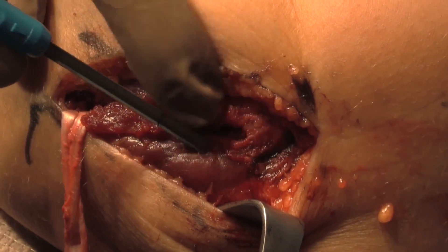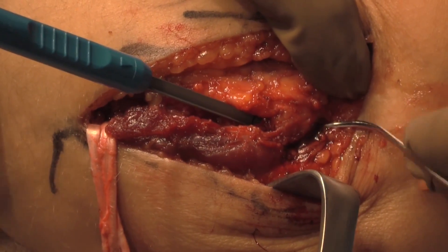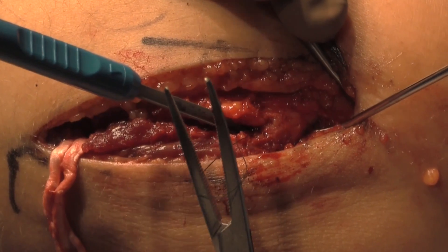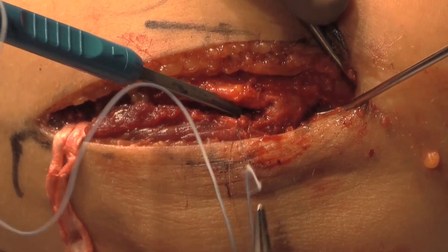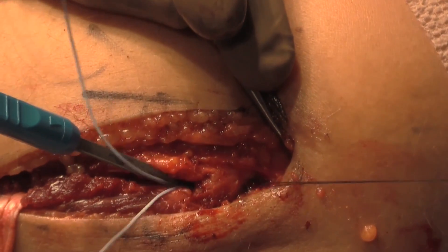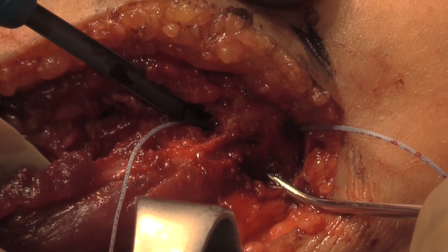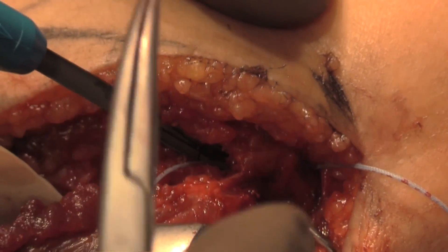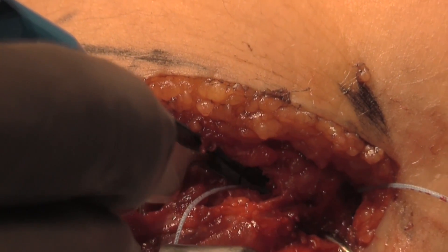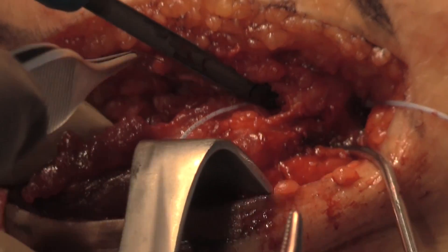At this point, a shuttling wire is then passed to allow the grafts to be brought into the docked drill tunnel. As can be seen here, the first set of passing sutures are placed, followed by the second set as is seen here.